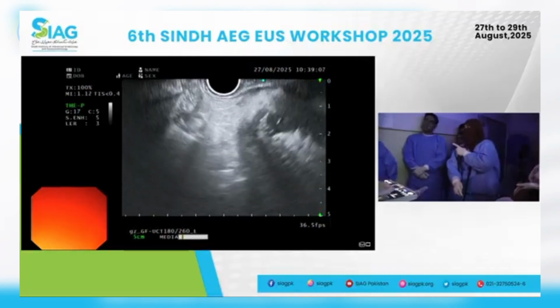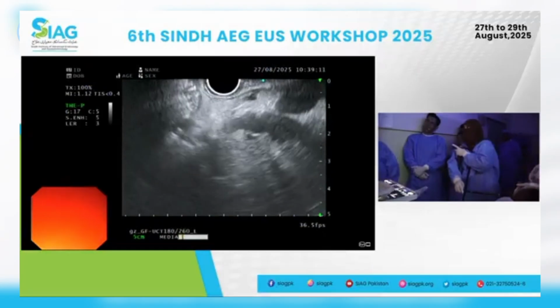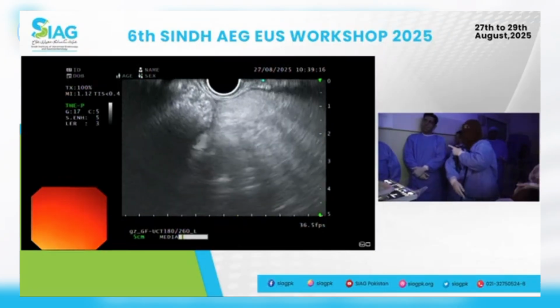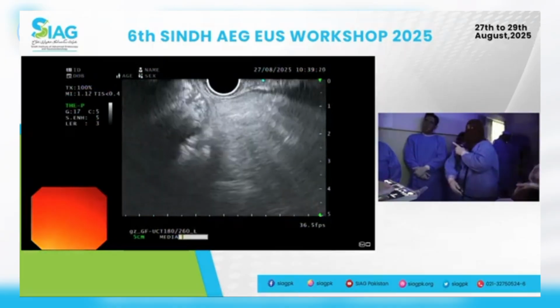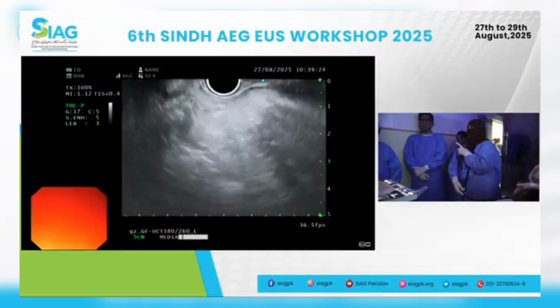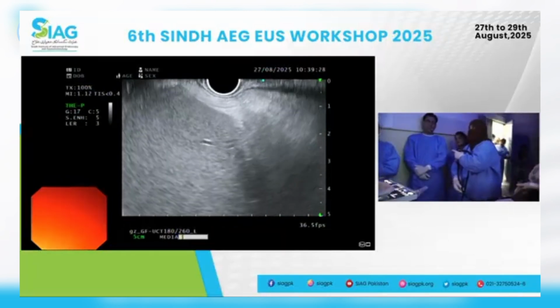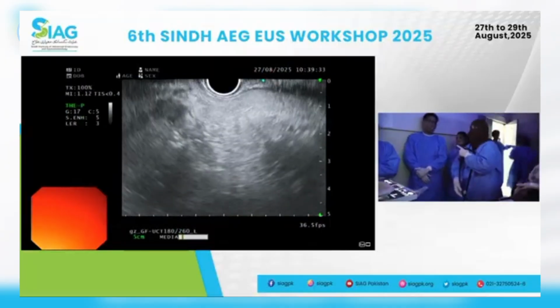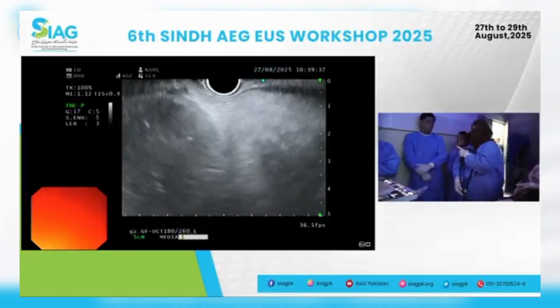Kidney coming down? Not yet, that's fine. Tip up, and rotate all the way to your right. Sometimes if you lose it, again you're excellent. So you're seeing the spleen. That means that if there's anything in the pancreatic tail, it's unlikely, if you've done a sweep and gone all the way to the spleen.